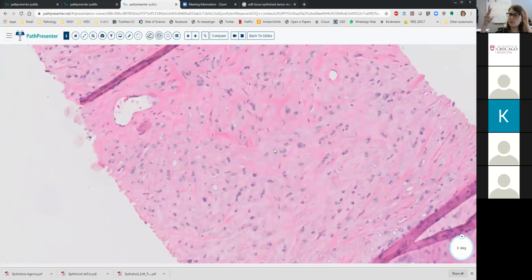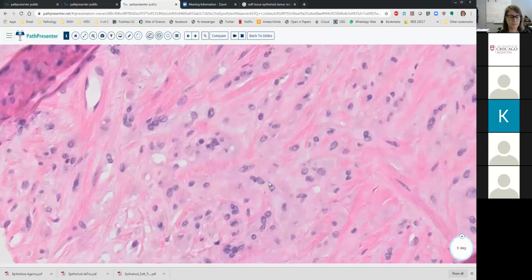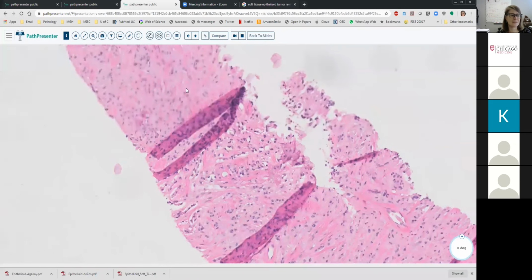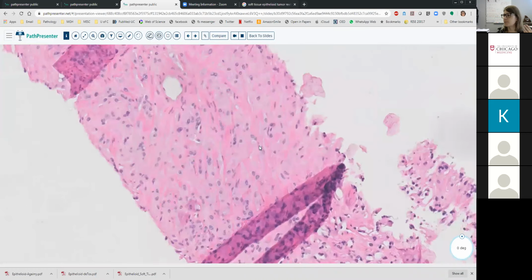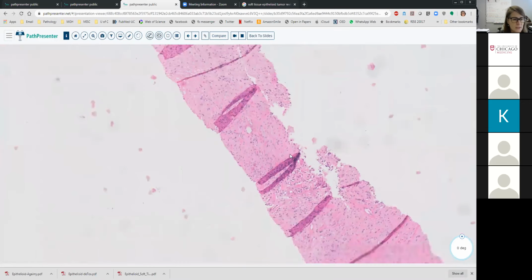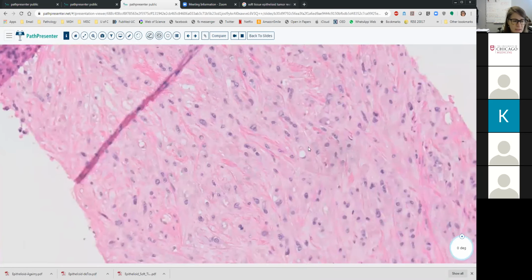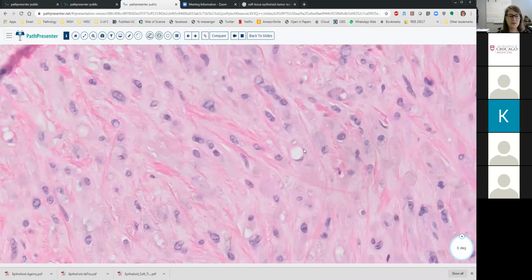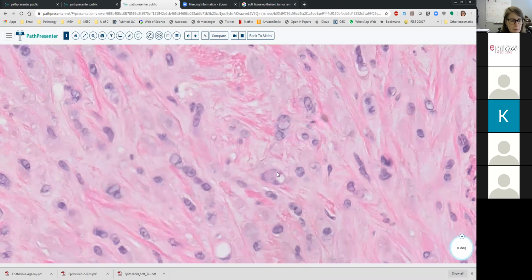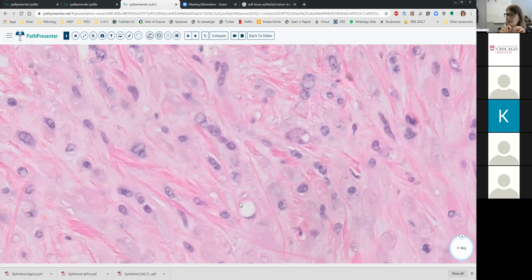These stain for two important things, one of which was already mentioned: vascular markers like CD31, CD34, and ERG, and the pitfall of all epithelioid sarcomas, keratin, right? So don't put a keratin on this and think, yep, this is breast cancer, okay? This is epithelioid hemangioendothelioma. If we are lucky, we may see endothelial cells within these. There's maybe one right there. So these are not filled with mucin. These are basically intracytoplasmic lumina, right?